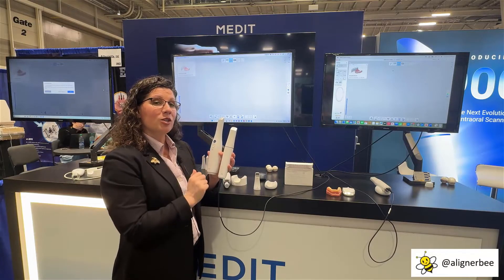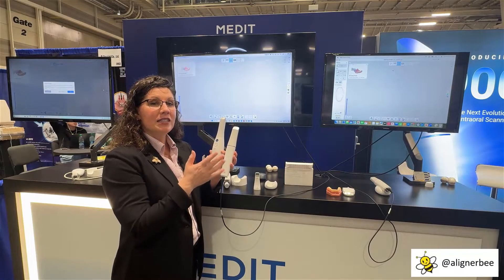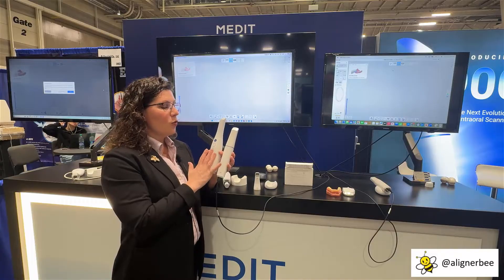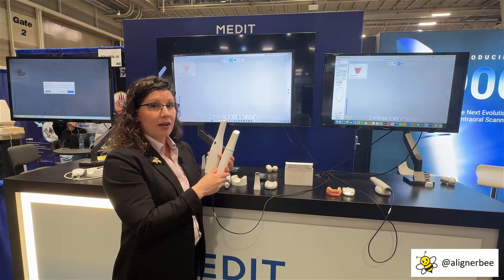There is also a touch pad to control the models on the computer screen without having to de-glove and touch the monitor or a mouse. Great to see the size difference and some of the more versatile features for utilizing and manipulating the models.